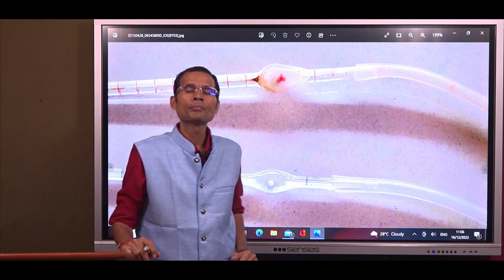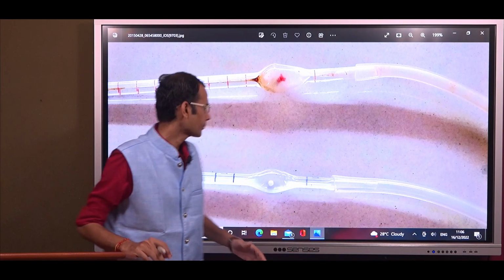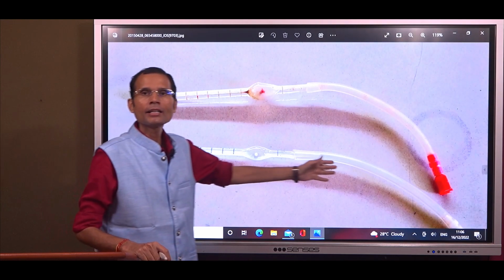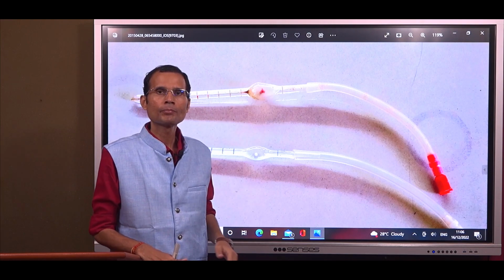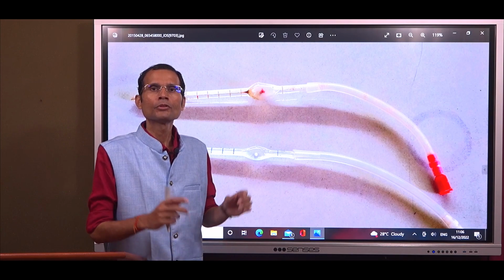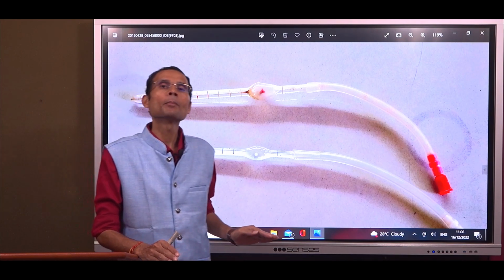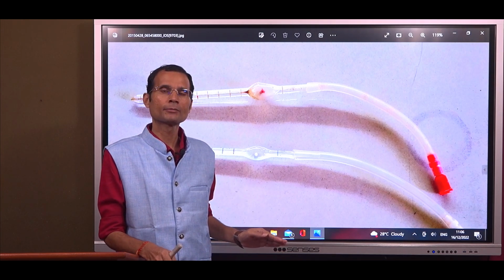One more point here. Are there any units to these numbers? 0.5, 1 and 11 or 0.5, 1 and 101. Are there any units, microliter, ml or whatever? No. There are no units to these numbers. I repeat, there are no units to these numbers.